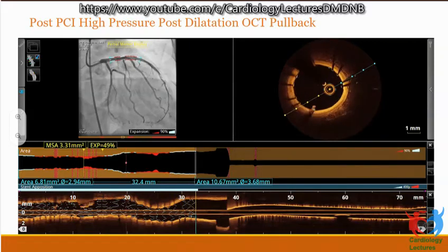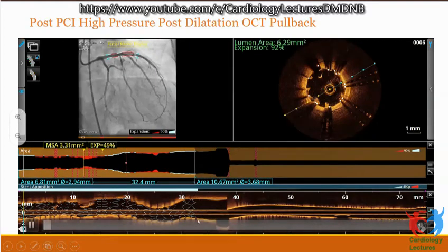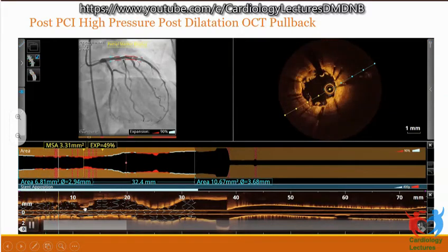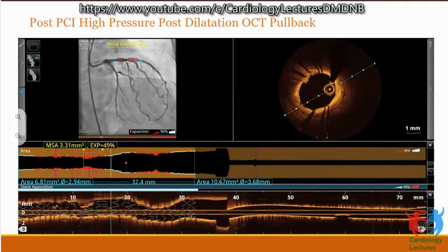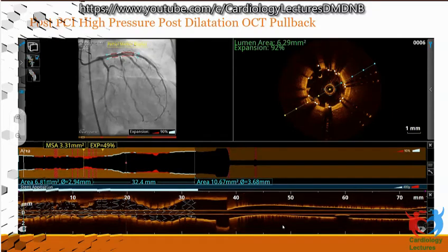Now the proximal part, which is toward the left main portion, is well-expanded and the apposition indicator tells you that the stent is well opposed. But if you see the longitudinal view, the moment the cursor approaches 12 or 13, where my pointer is now, you will see the cross-section absolutely studded. So not only in the cross-sectional image, you can also see there is a lot of white thrombus.